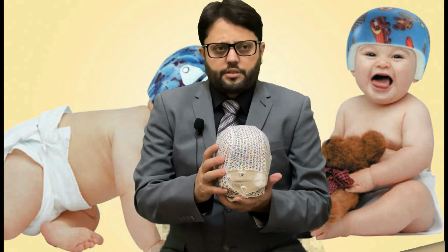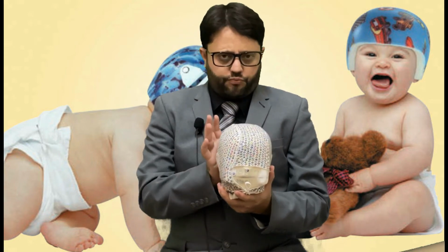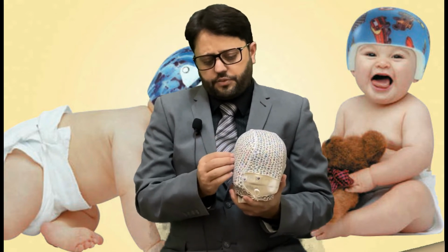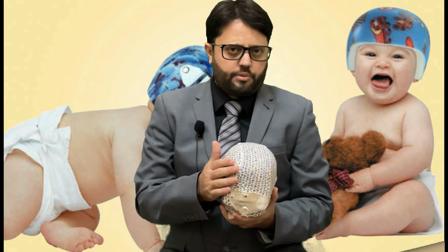In severe cases, there are chances of an anterior shift of the ear on the side which is more flat on the posterior, so that ear will be anteriorly shifted. If the anterior shifting of the ear as compared to the other side is more than 6 mm, we consider this an abnormal ear shift.